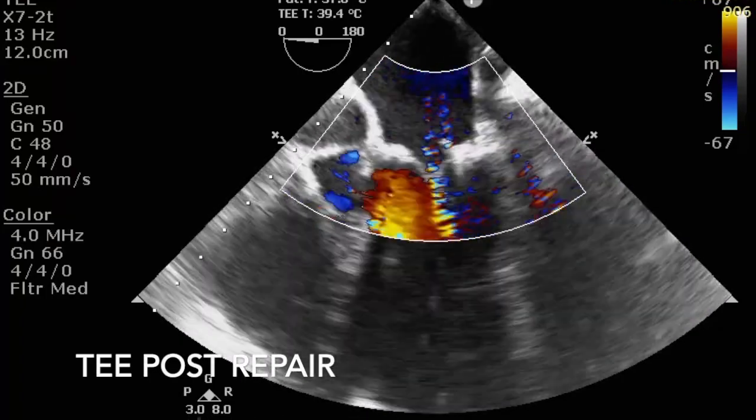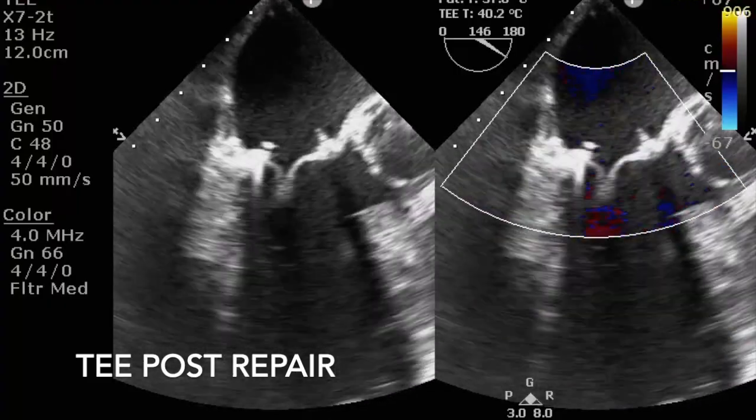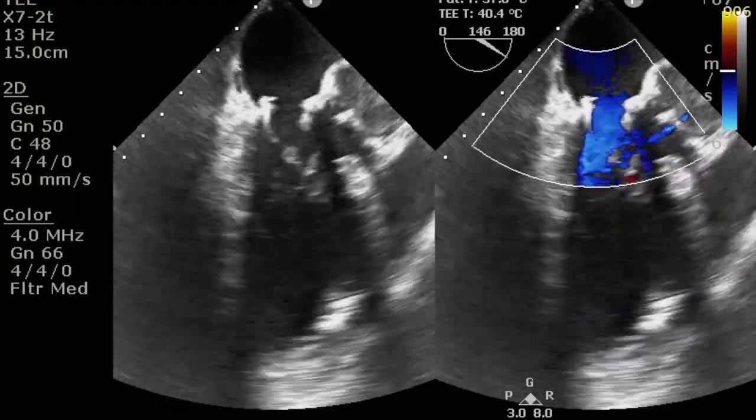I spent some time adjusting the length of the Roman Arch, but the result was eventually good. I must say it is a useful technique and it should be in every surgeon's portfolio.